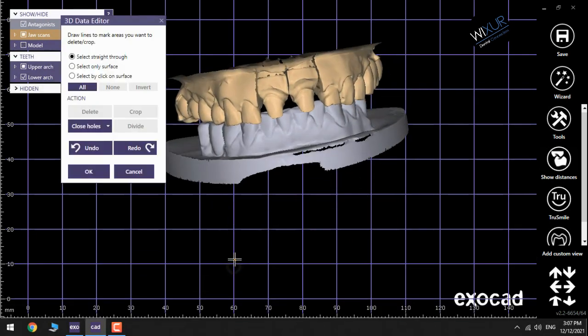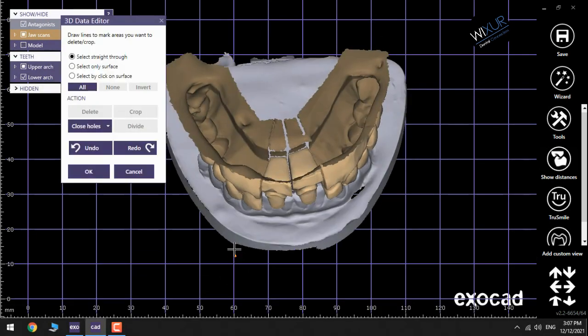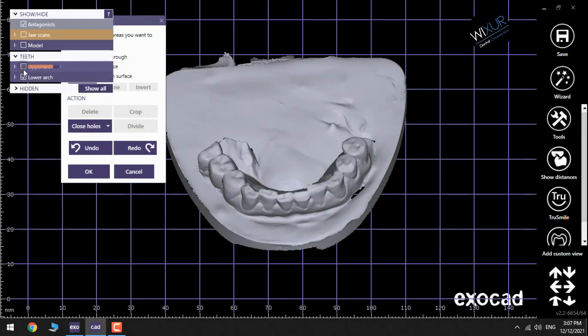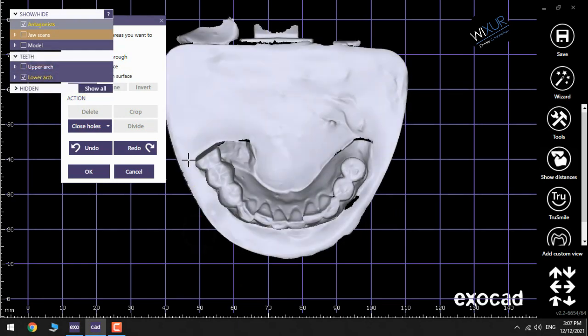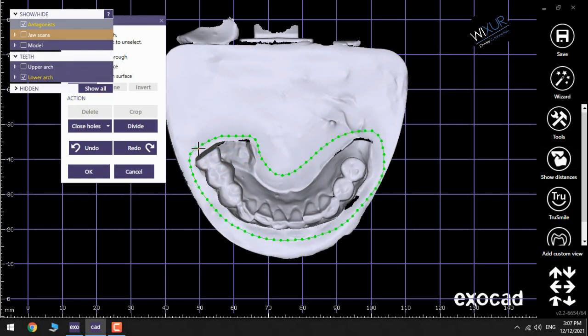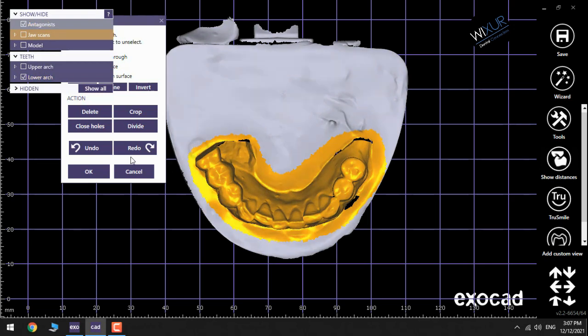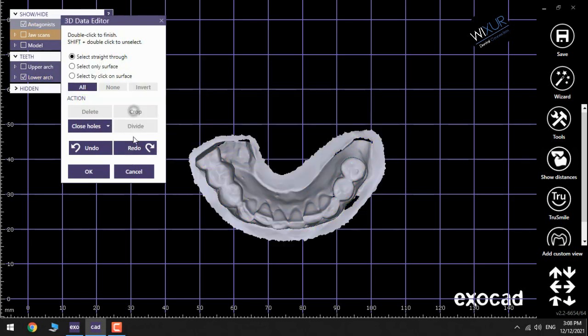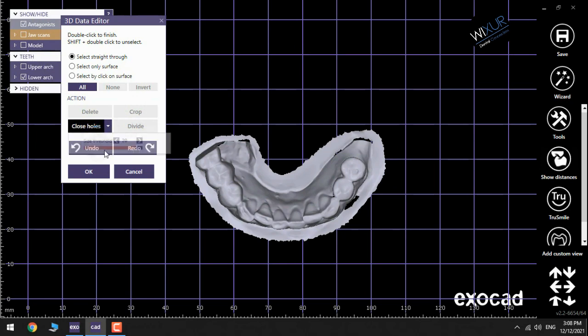Start choosing which part you need by clicking and adding more dots. Click on the mouse, crop, and again close holes the maximum amount and then Okay. Go back to Wizard.